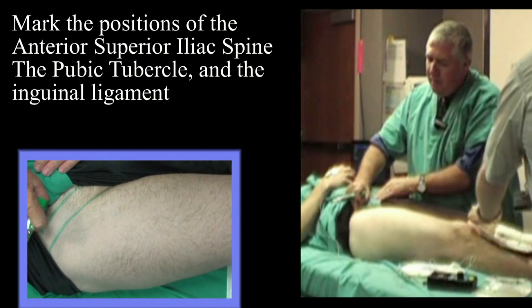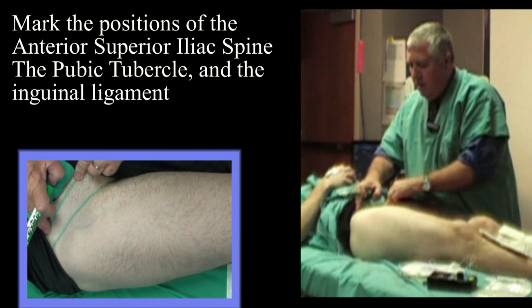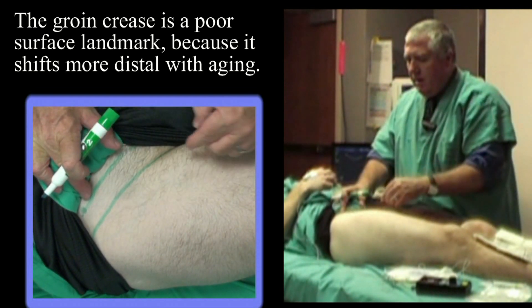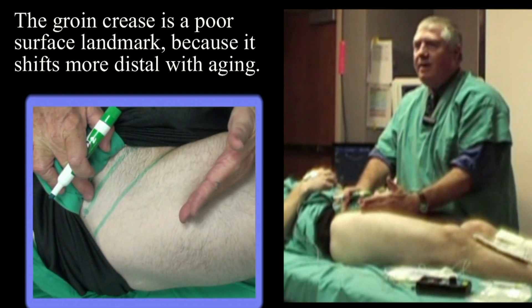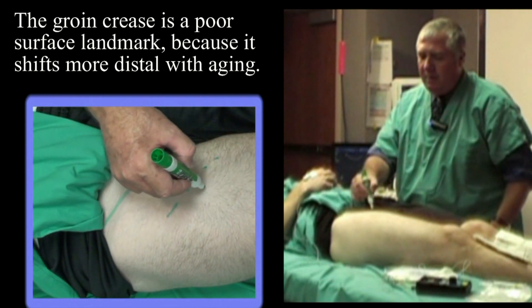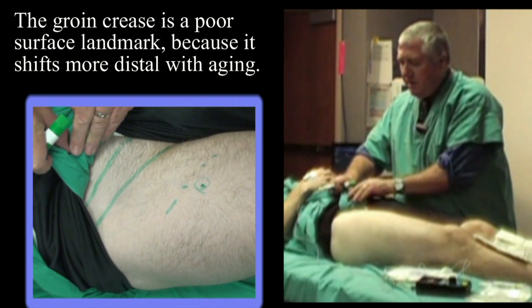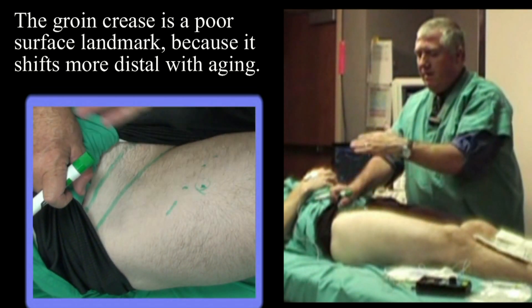We identify the anterior superior iliac spine at that point there. We identify the pubic tubercle just over here — you know you have got it because it causes a bit of discomfort. We join the two together and we have the inguinal ligament. Over here I have marked the groin crease, and in a young person that is quite close together. In an older person the groin crease can be 15 cm down the leg. So if you use the groin crease and go 2 cm below it, you are going to be doing a mid-thigh femoral block that will be very incomplete. You really want to get as high as possible and as close to the inguinal ligament as the patient's anatomy will permit.